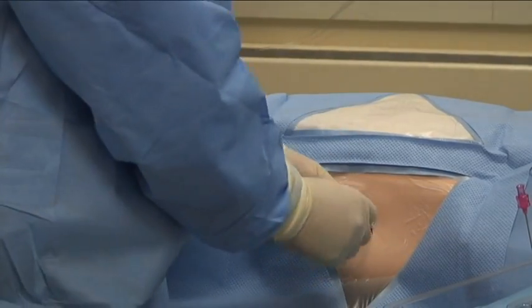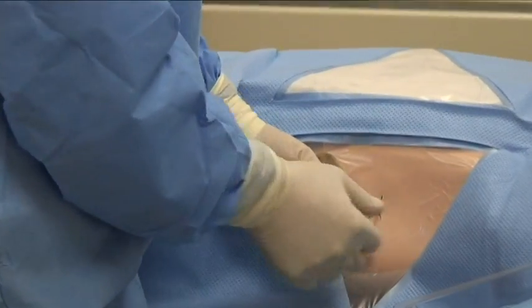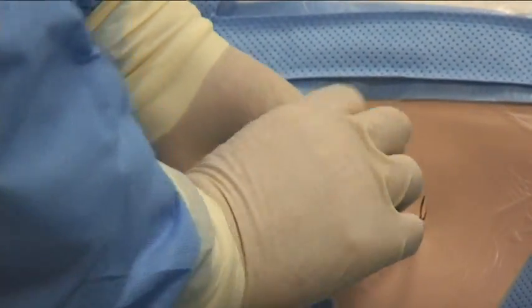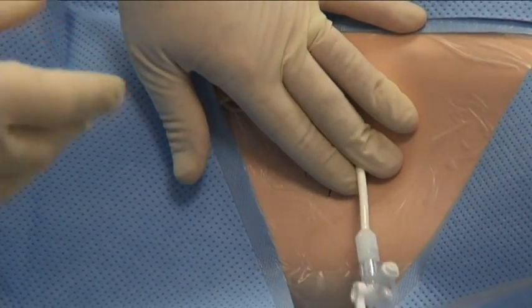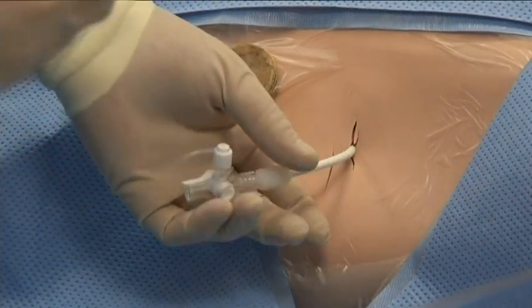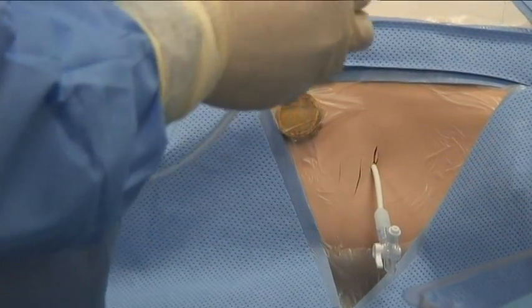At this point, the valve, you can close it, or you can turn it this way or this way. You can put a cap on it here so you don't have any leaks. You can close it off to the system if you'd like, as you suture it in place. However, if it's a pneumothorax and you want to drain it, you may want to immediately attach it to your Heimlich valve or to your pleurovac. So I'll show you how that's done.